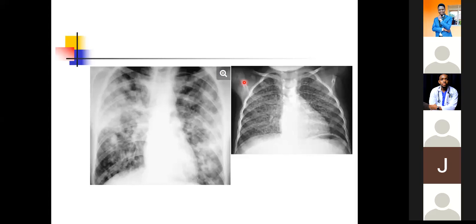It takes experience to actually be able to understand and also to be able to pick them. Ground glass, typical on CT. When we image these patients with a CT, we use the high resolution CT protocol. That protocol is specially designed to show us those diffuse lung parenchymal disease processes.